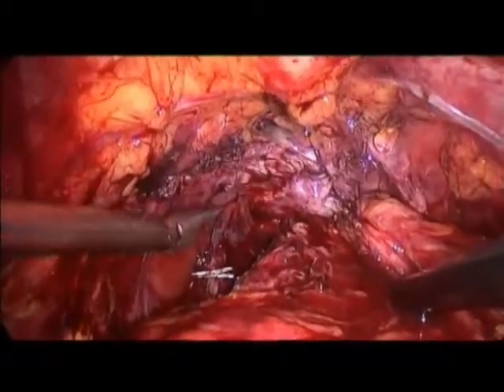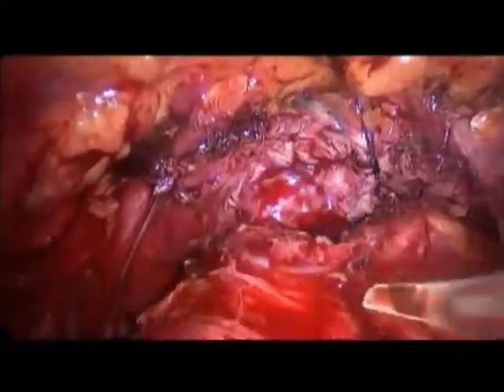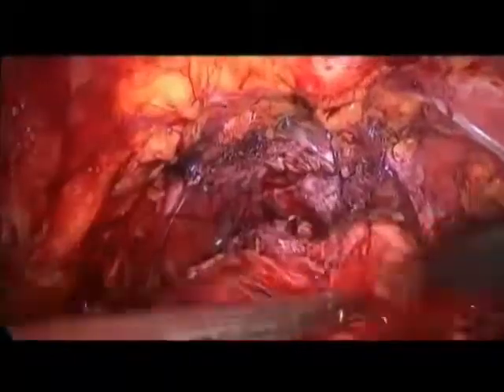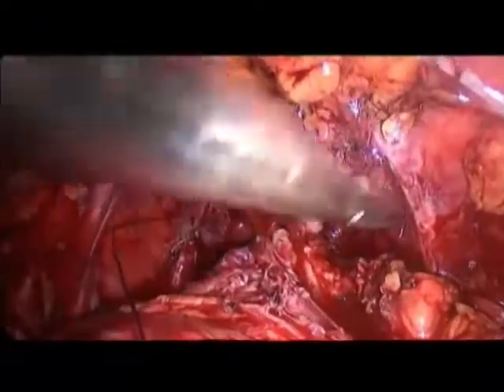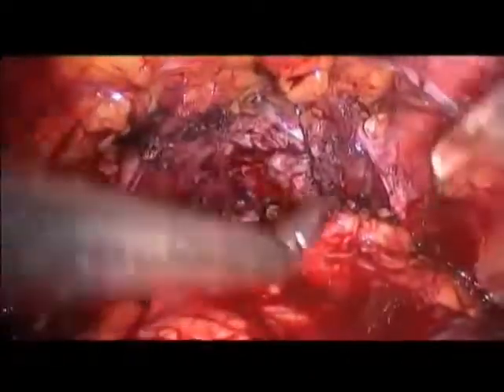This was 9 o'clock and 10 o'clock. Okay, this is enough. So now you could use this once again, I see. And we will just. So, can you try to insert the catheter now? I think this is. Yes, this is enough to insert a catheter.